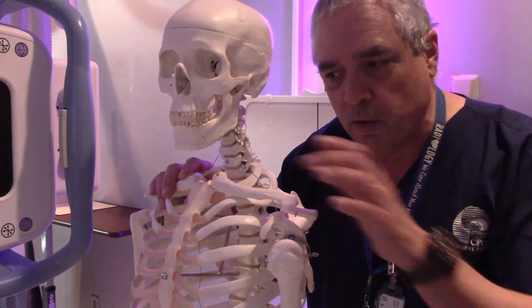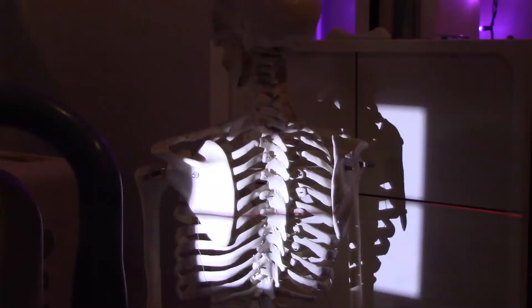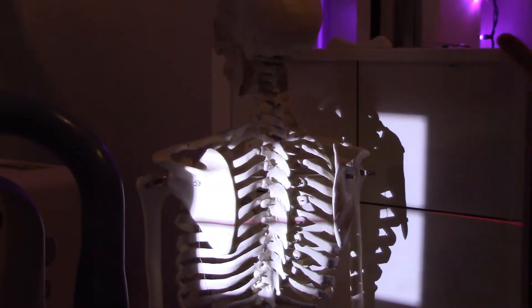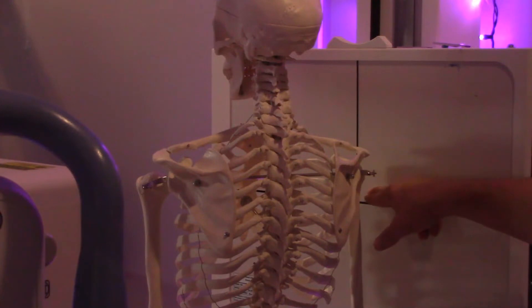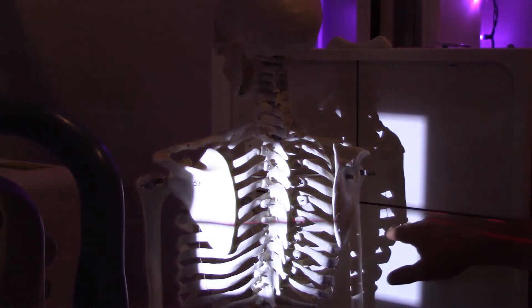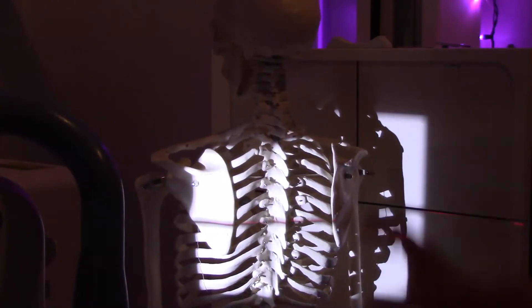I'm going to bring Boney here over to the board and set him up for some X-rays to see how that looks. I've got my tube in detent, and I've got my image receptor aligned so that the center of my image receptor is approximately at the level of the surgical neck of my patient's humerus. I've got my tube lined up with my image receptor, and I'm coned down to a 10 by 12 image receptor size.